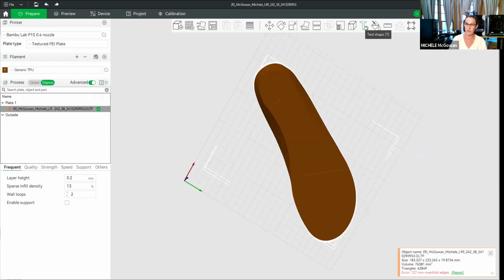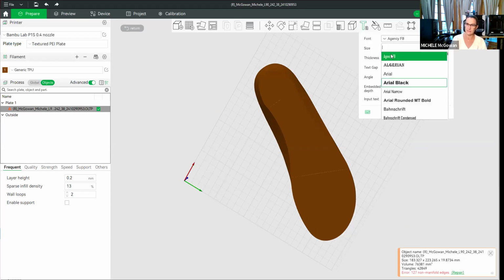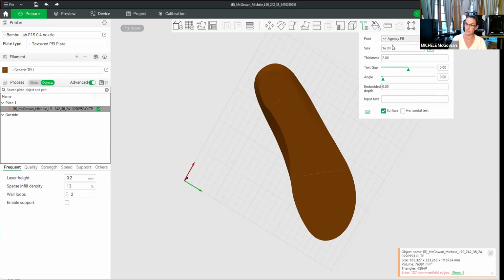There is a really neat button and feature up here where you can see it says T. That is to add text. It's pretty cool. There are all these different text fonts. I'm very lazy, so I just stick with the default. Size 7 font seems to work for me because my office is the Center for Ankle and Foot Care, which is pretty cumbersome to have all of that on the bottom. So for my practice, I put centeranklefootcare.com, which is our website, and the patient's name.